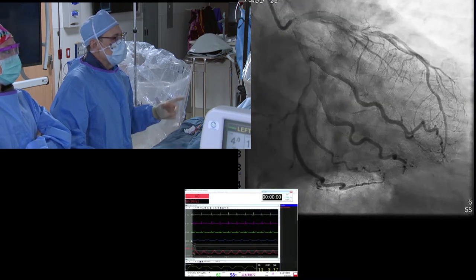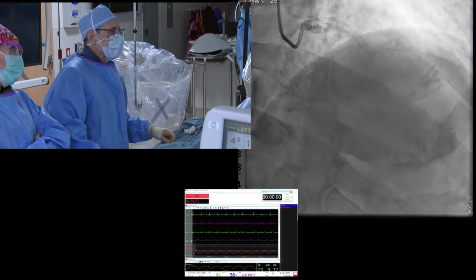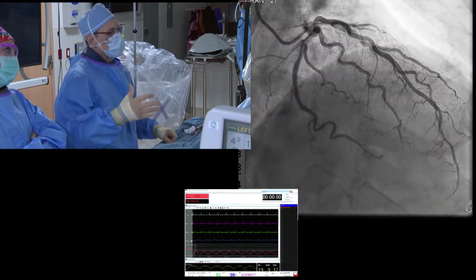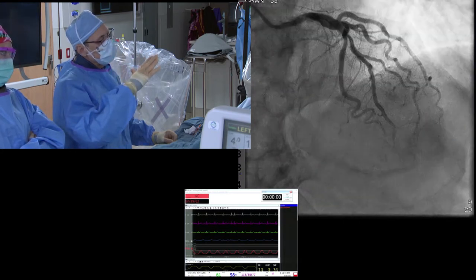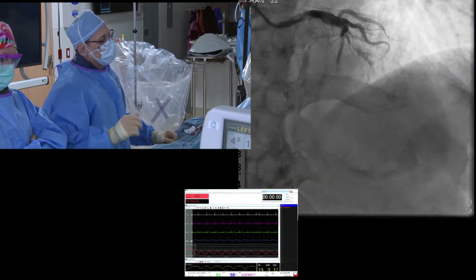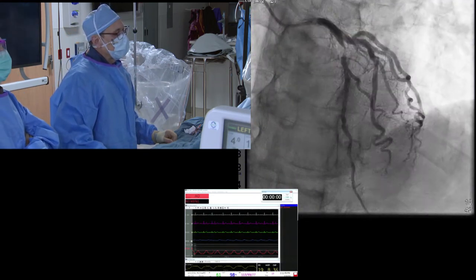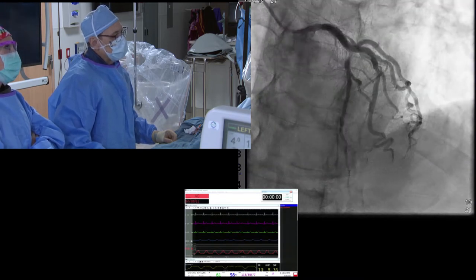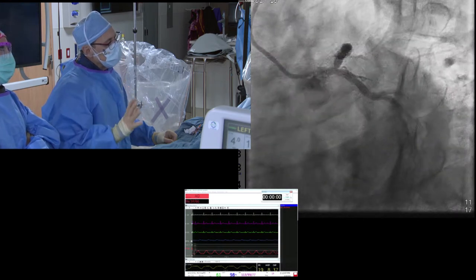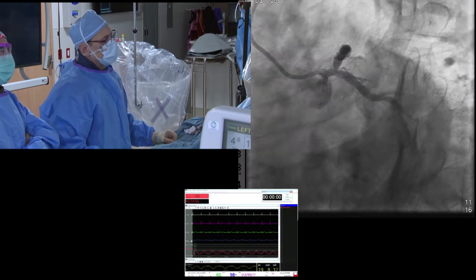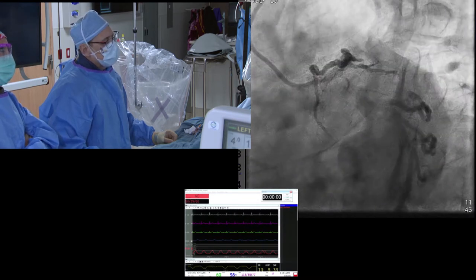I'm also seeing something at the ostium of that LAD or distal main. You can see there's overlap of the circumflex, so we want to give cranial angulation to pull the circumflex off the LAD. The next picture is an LAO cran, and now you see it more completely. The spider view is a little difficult to get clean, but it does suggest there's something in that very proximal LAD.